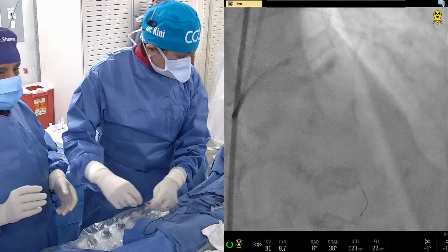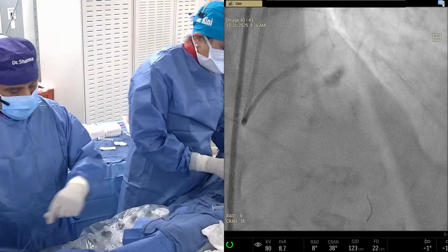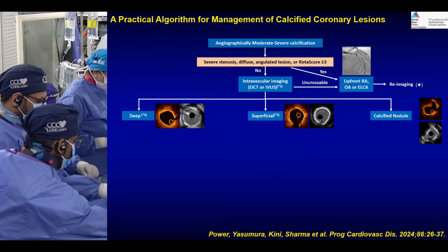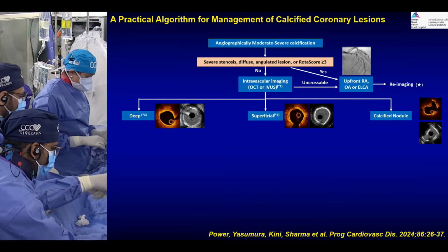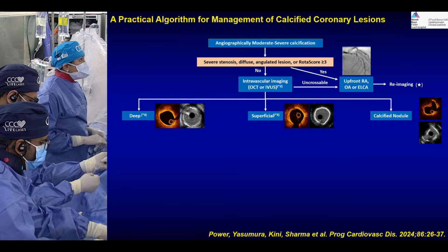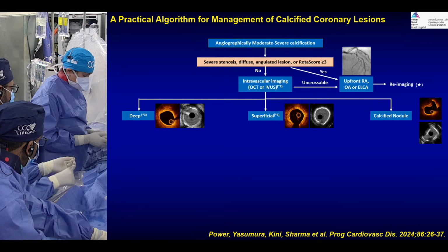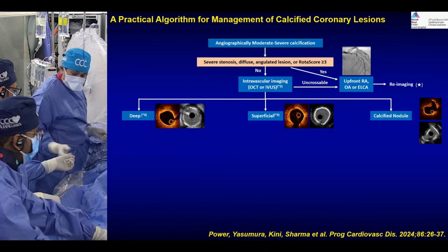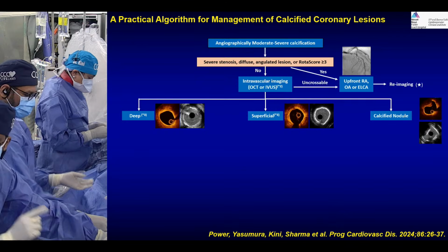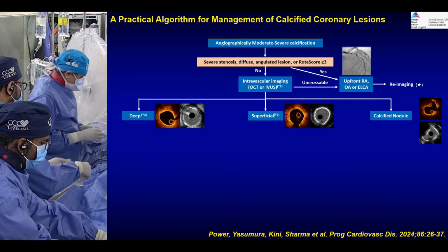Okay, get us IVUS. You plan to do IVUS on the rotawire? I'm just on the rotawire. What I'm trying to teach is, many people always ask this question: how to decide the burr size. We have been teaching that we look at the vessel size from our eyes, but for the younger generation, I need to teach how, based on the imaging, we can select the burr sizing.